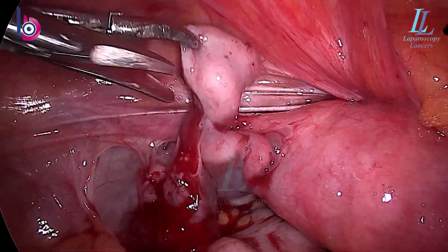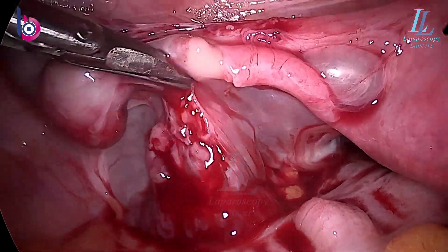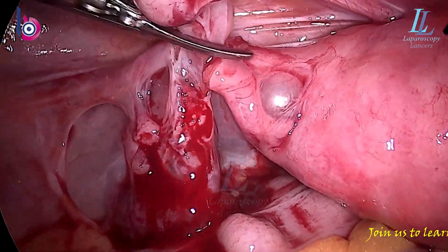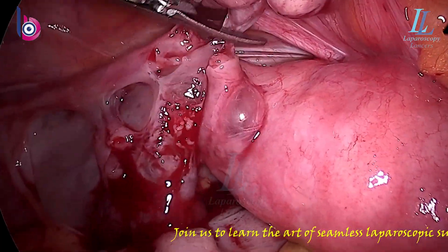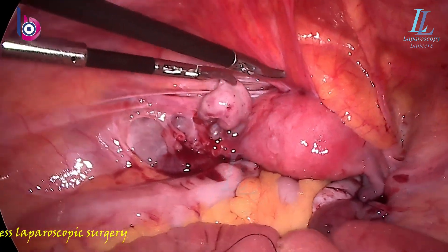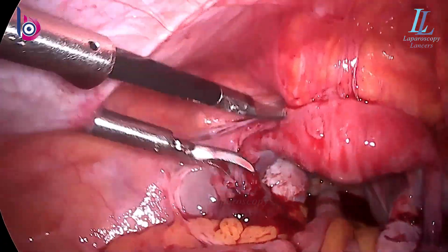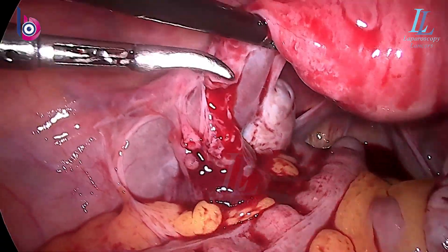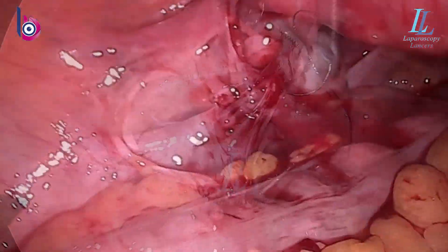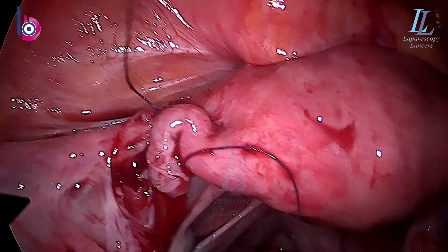The beading continues. I'm dividing the mesosalpinx and going over the fresh-looking end to divide it — and again lots of pus coming from that side. The chances of success of this surgery — you can obviously guess how much it can be. We'll see after three months, but we'll do our job and anastomose it. We have a uterine manipulator in the vagina pulling up the uterus; the bladder adhesion is also helping. You can see the fresh cut end; it looks quite okay with no pus coming from the uterine side. One suture in the mesosalpinx to approximate these two ends.